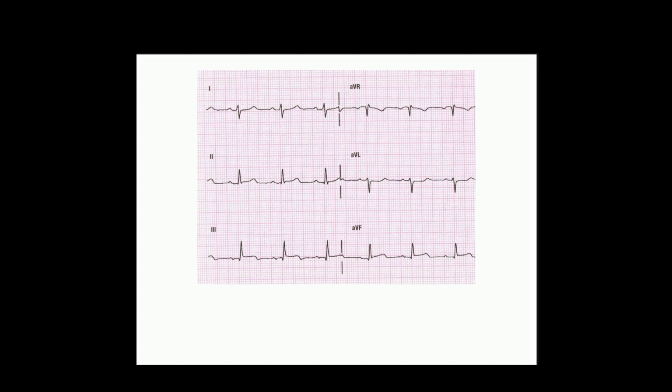By the way, in terms of this particular STEMI, what else makes you think, oh yeah, there's problems in the inferior leads? Besides the ST elevation and the reciprocal changes, what else doesn't look great in the inferior leads?